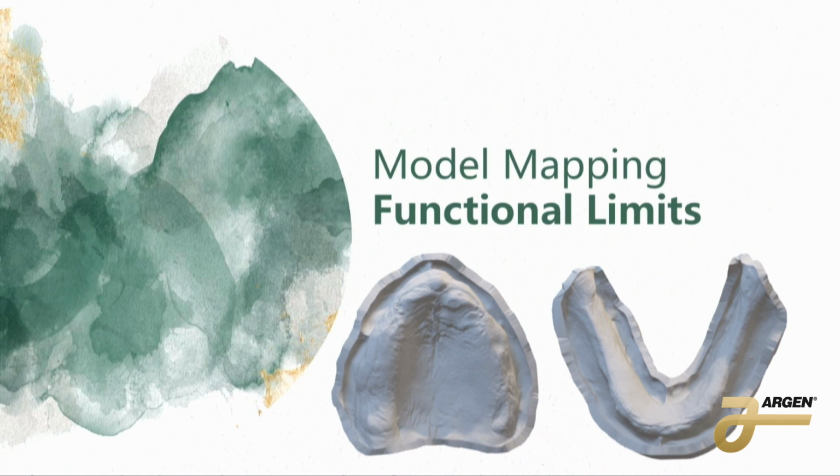If we get movement, now we get a sore spot. And how do we fix a sore spot? Typically, your practitioner will just grind it out. They're not looking for any other reasons as to why this might be a sore spot. It might be moving because the border's too far back. It might be moving because we didn't cut out a frenum all the way. It might be moving because our teeth are set too wide and now we're wobbling, our forces are distributed wrong, right?